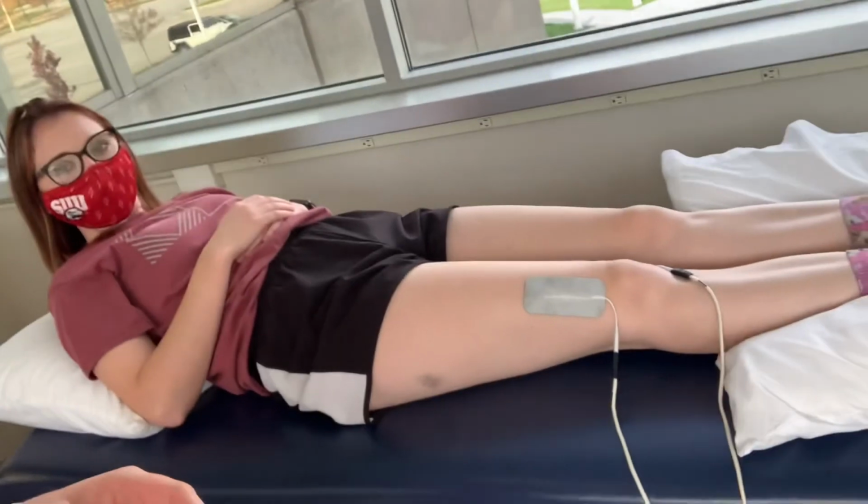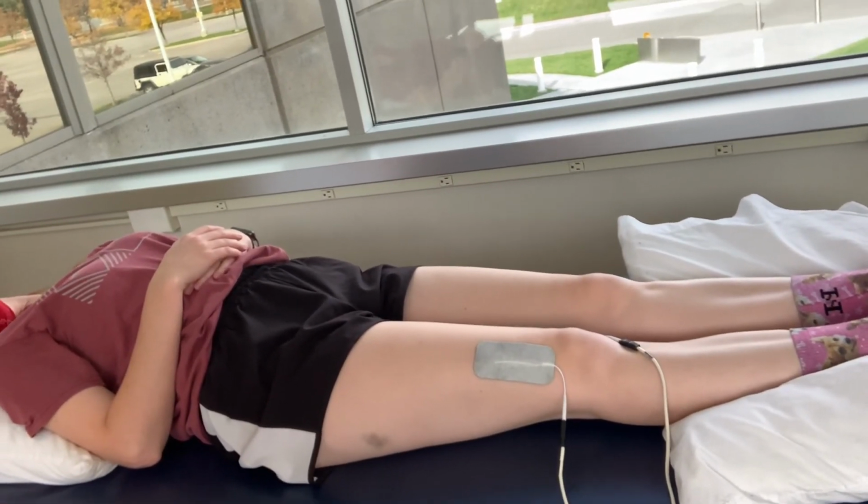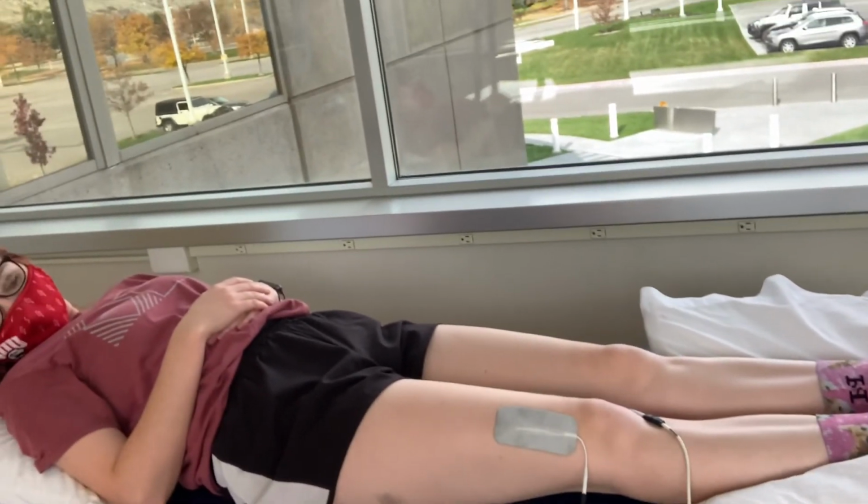So we have our patient positioned here. She is comfortable and we're leaving that on for 30 seconds. And we have it set to continuous. We don't have any ramp up or ramp down time, and we have it set to biphasic and normal. So that's been on for 30 seconds now. For the sake of the video, we'll go ahead and stop this now.